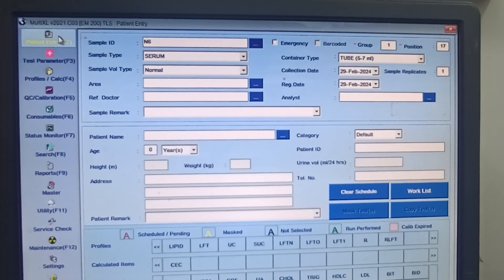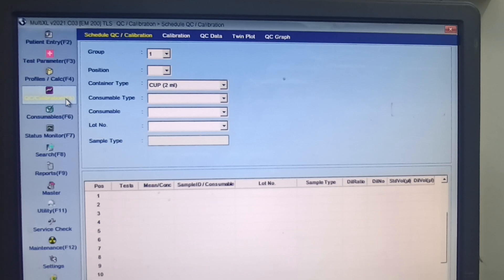To perform the calibration, you have to go to F5, which is the QC and Calibration button. If you press the F5 button, such a menu will appear. In this menu, the position is very important — you have to use the drop-down.